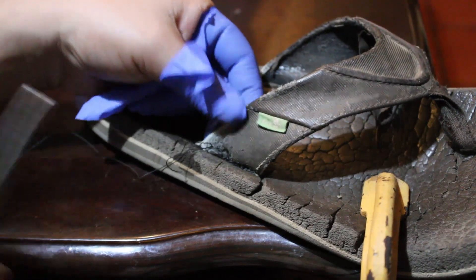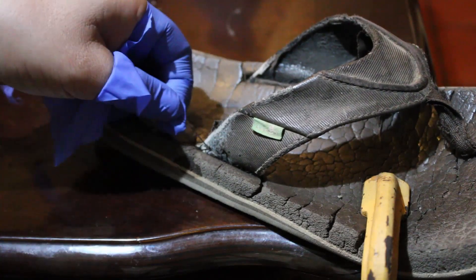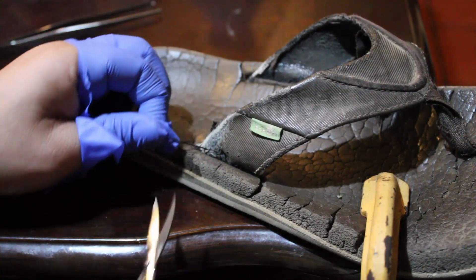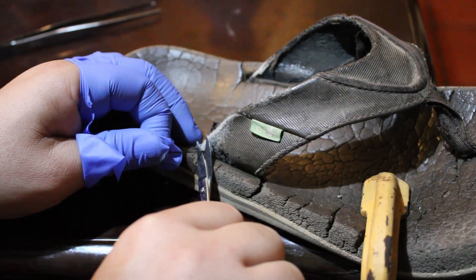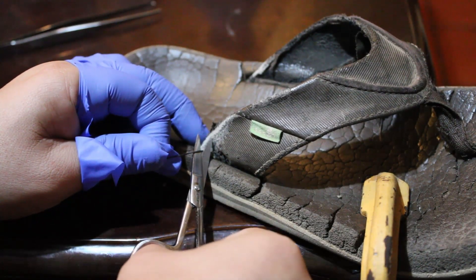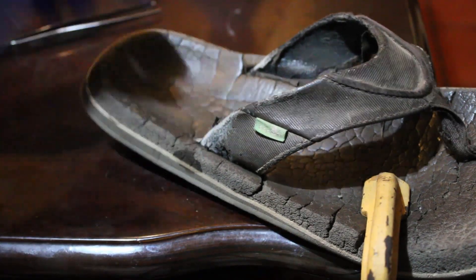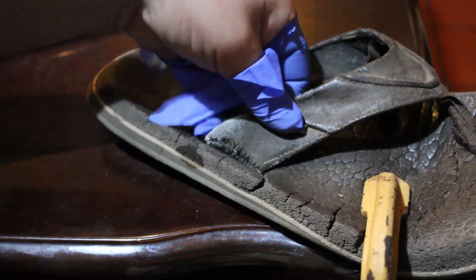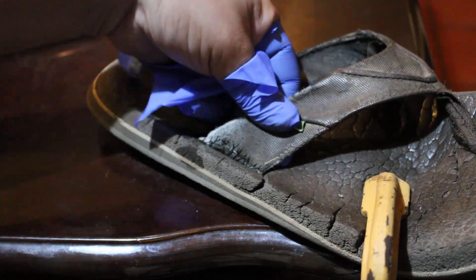This patient can go back to lifting. To finish off, grab both ends of the string, place your scissors parallel to the wound and parallel to the tissue, twist them a little bit before cutting, and cut. And there you have it — happy stitching, bye bye!